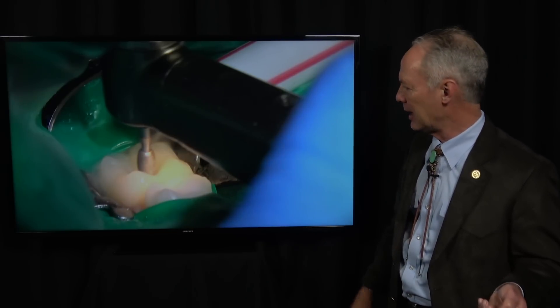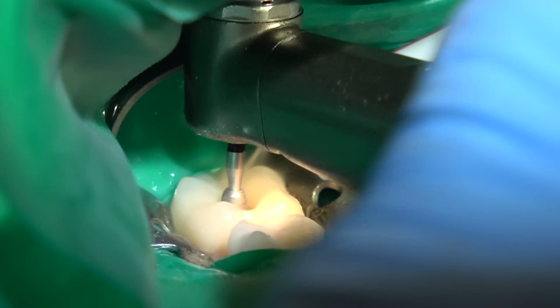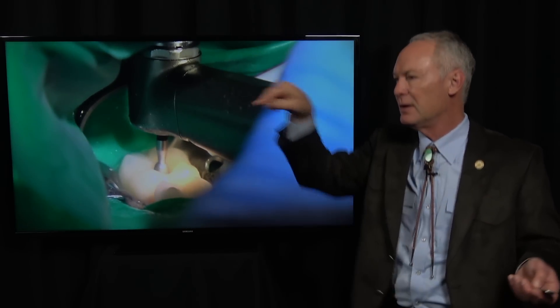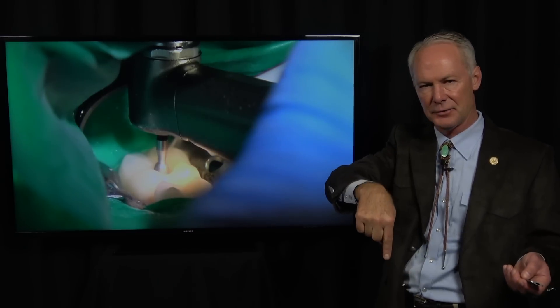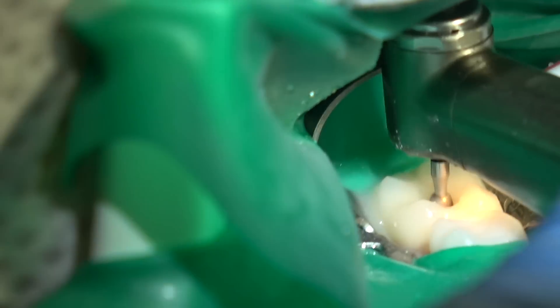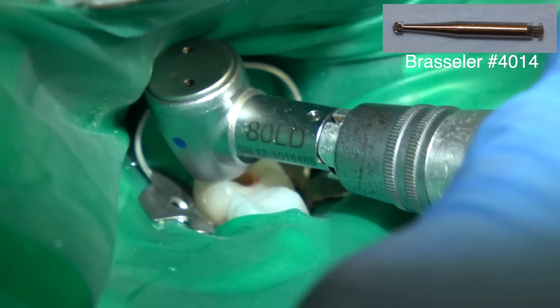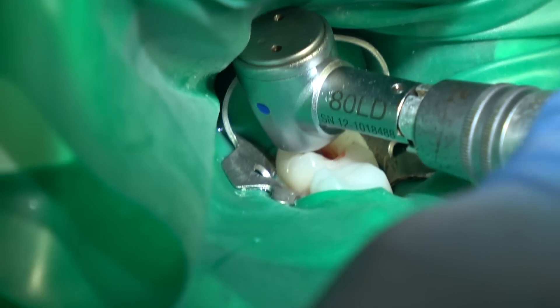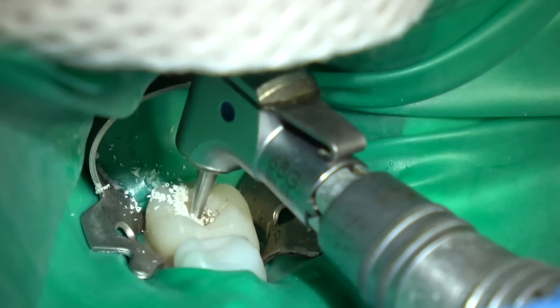Very light pressure, lots of water, high speed. You want your access hole to be large enough that you've got straight entry into the canals — you don't want to be going like that with your drill or your files. You want straight entry into the canal, so you have to make an appropriately sized hole. Once we're into the pulp chamber, I'm going to come back with a slow speed number six round bur and just open everything up.